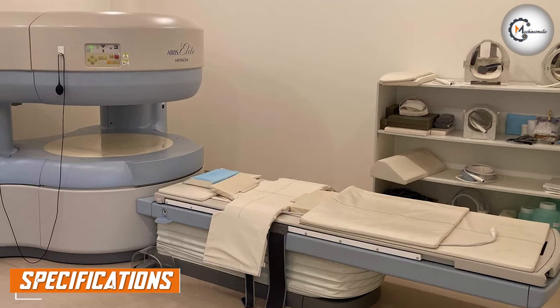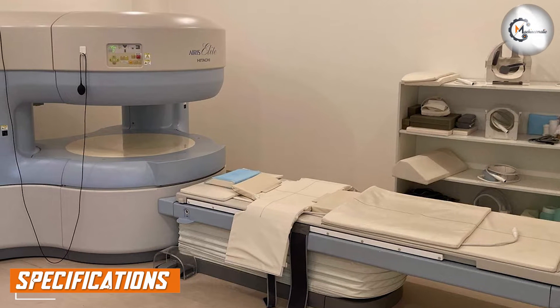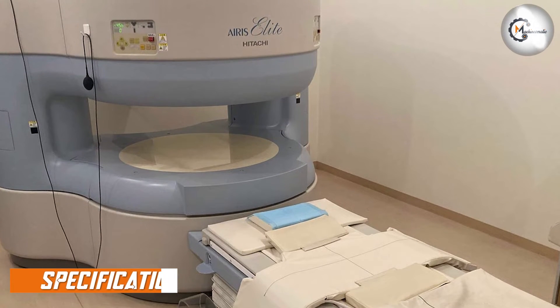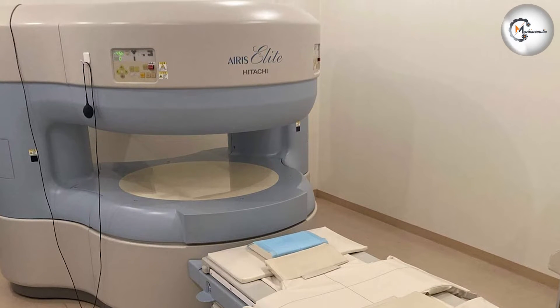The MRI machine has a bore size of 60 cm, making it suitable for patients of all sizes. It has a gradient strength of 15 mT/m and a slew rate of 33 T/m/s.